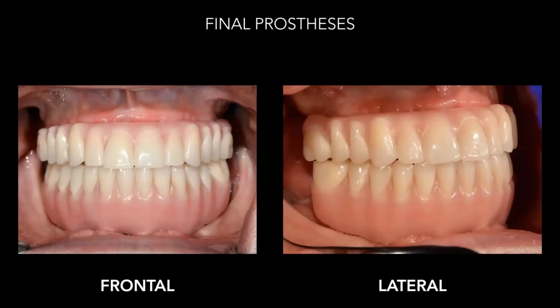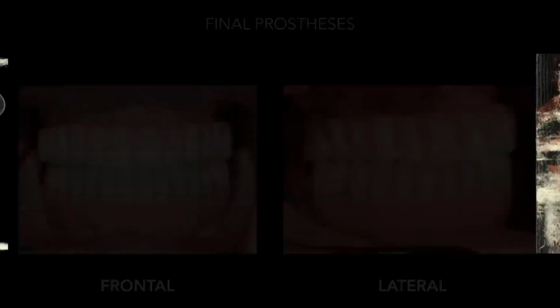And now it's been 8 years. I think the most recent photos I have in the presentation are at 6. But super stable, super extreme. I could not in a million years have done this with as much minimal invasiveness, but also with as much predictability and stability, without having a cone beam CT scan machine to utilize.